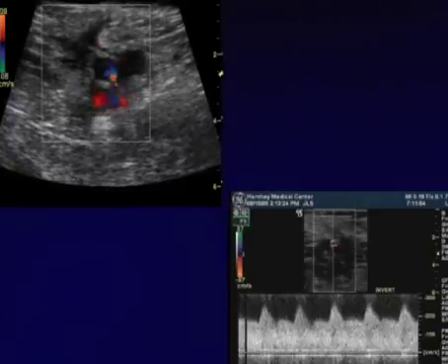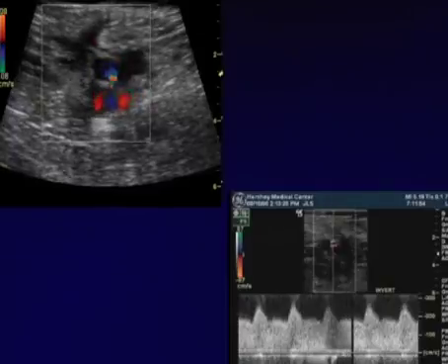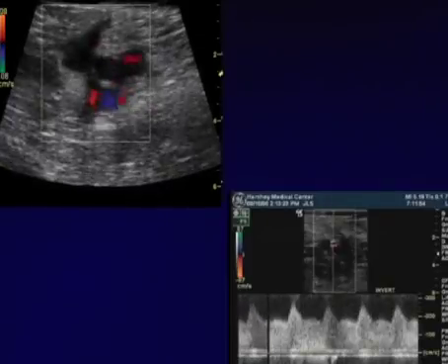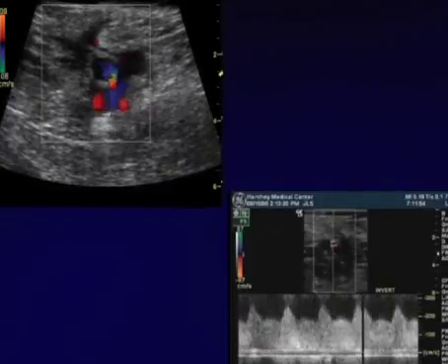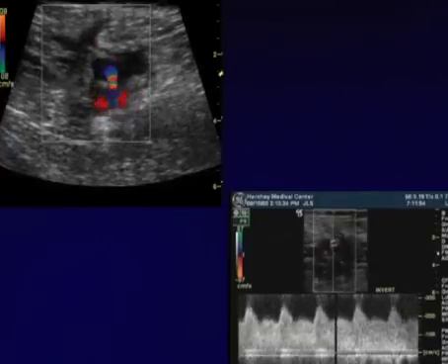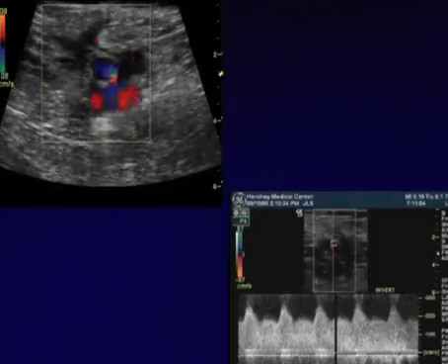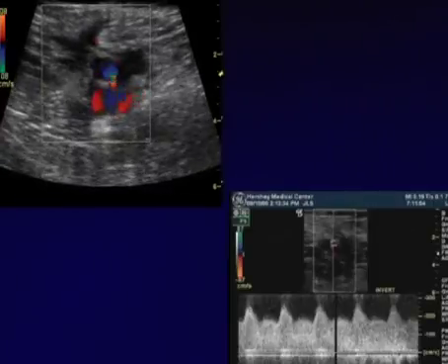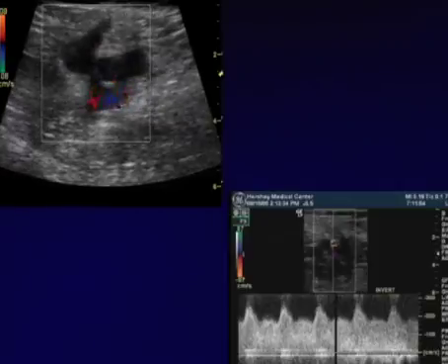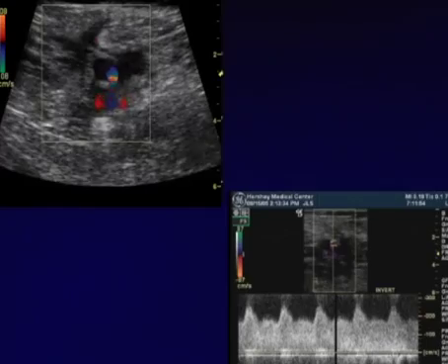Now I'm going to show you a loop of the Doppler pattern, and you can listen to this, and I'm sure can appreciate the high velocity, high volume flow that's screaming out through that little connection. That vein presents a nice low resistance pathway, so the blood prefers to go out that low resistance pathway, and we can hear that turbulence and see that elevation in velocities.